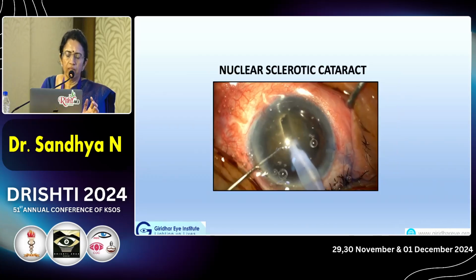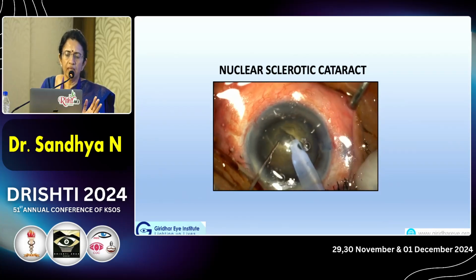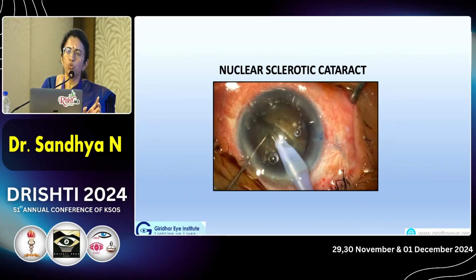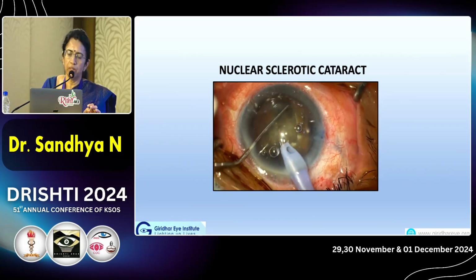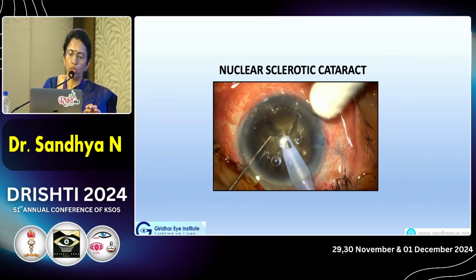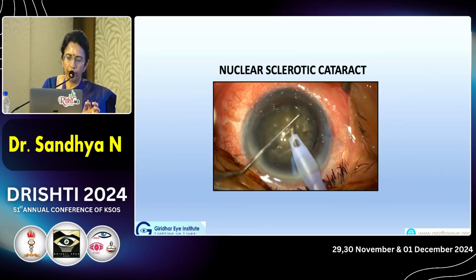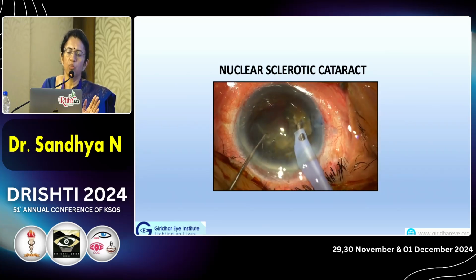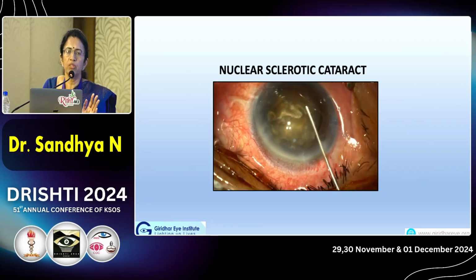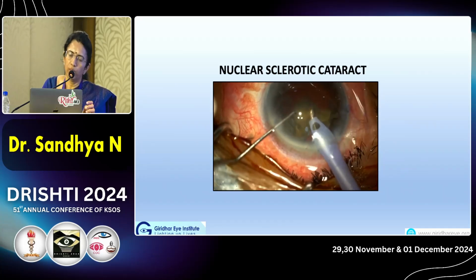Now the cataract in these eyes tends to be typically of the nuclear sclerotic type, and they will have a leathery texture and a hard endonucleus. The clear corneal tunnel should not be too long, because the anterior chamber is already deep in these vitrectomized eyes. If the clear corneal incision is long, you will have to hold the instruments more vertically, which will cause difficulty during nucleus manipulation. Also you should chop the nucleus into multiple pieces, and after protecting with dispersive OVD, you should emulsify these pieces using low ultrasound energy so that there is less damage to the corneal endothelium.